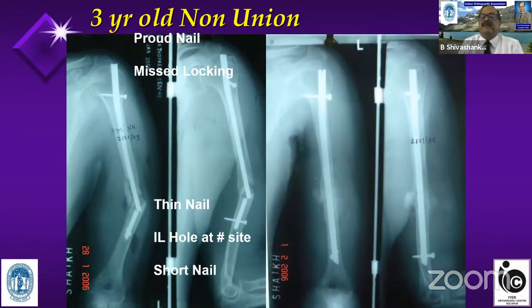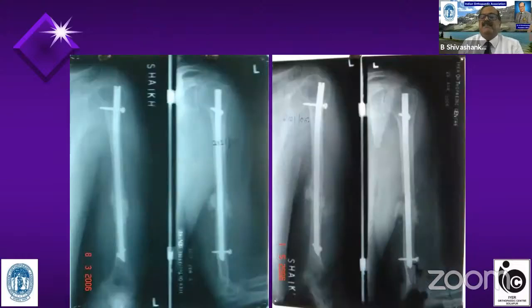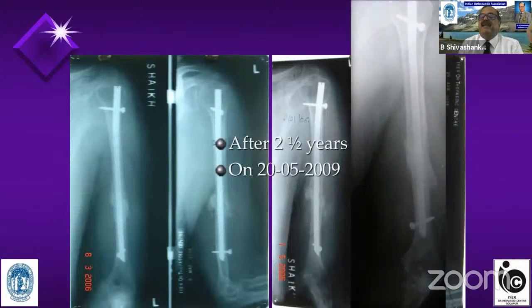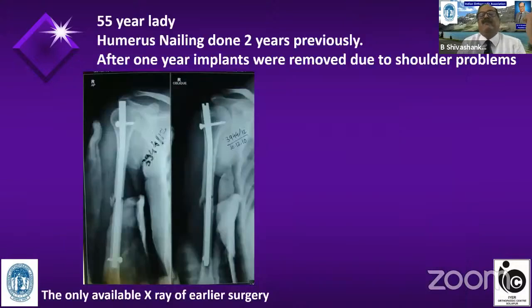So I treated this patient with a thicker nail, reamed, thicker nail, and this is subsequent follow-up. At 2.5 years when the patient came, you can see that beautifully the fracture had consolidated without any problem. So what I'm telling is, properly done nailing is more important.